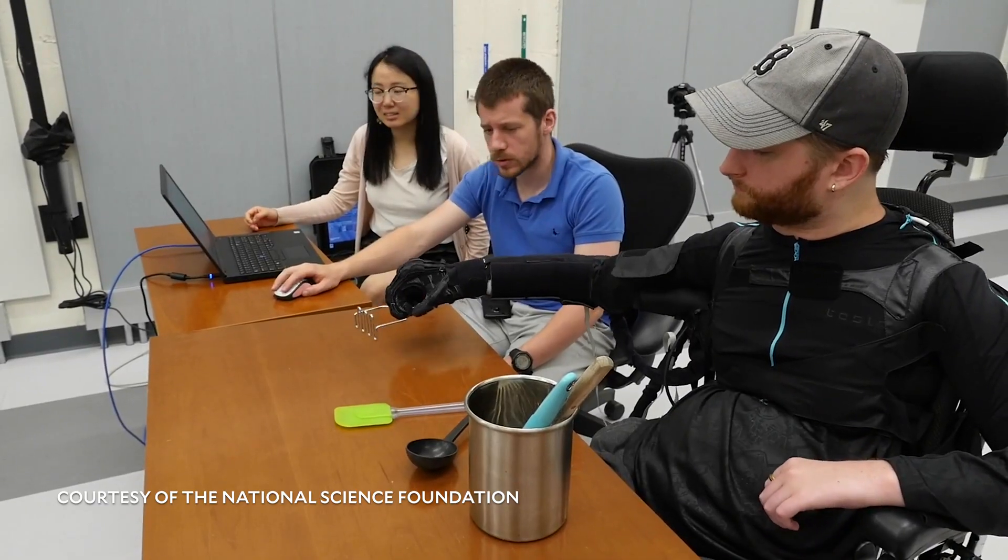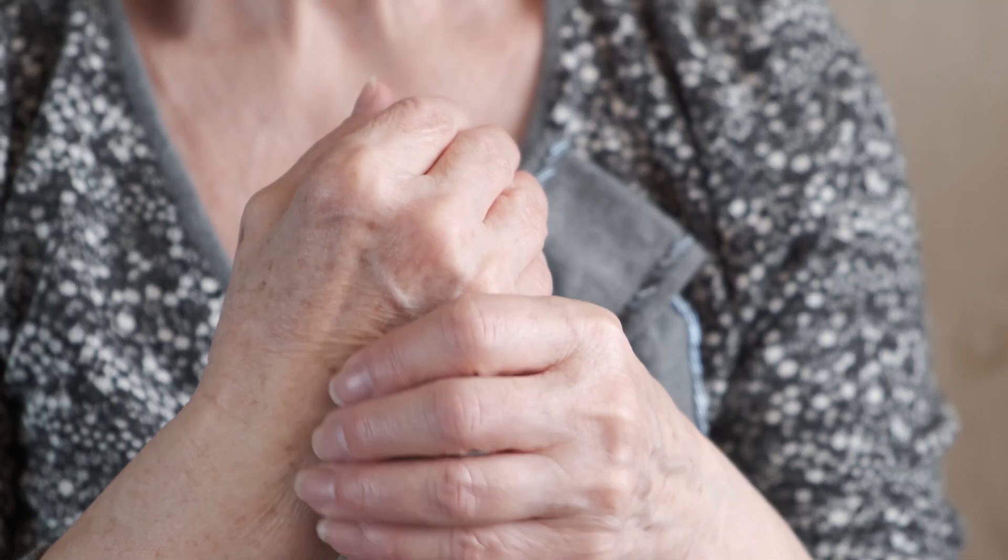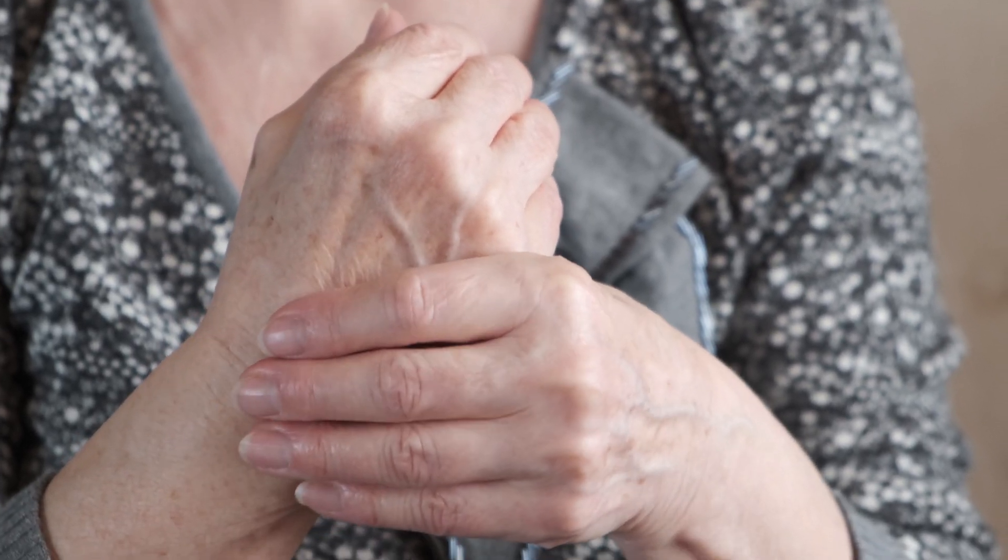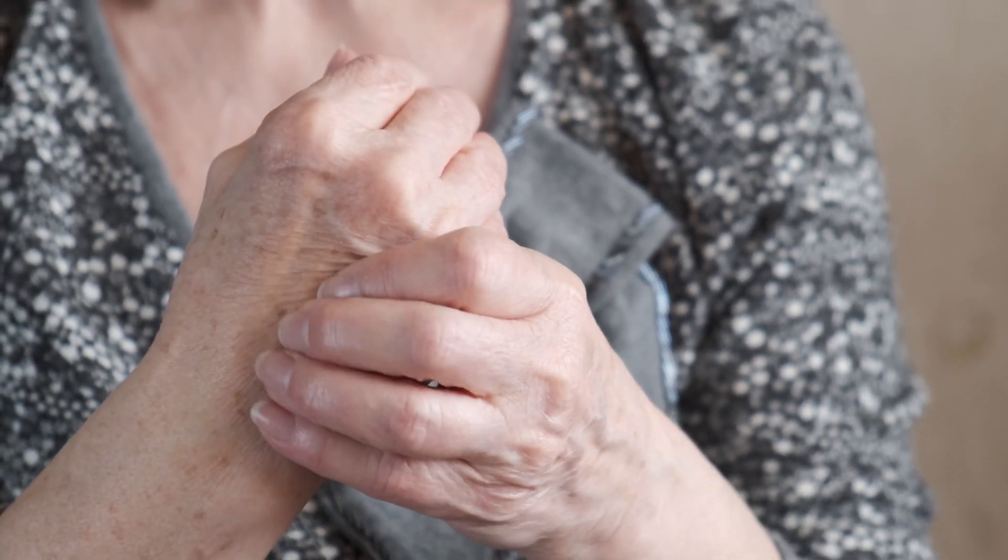There are a lot of wearable assistive devices that have been developed in the past decade, and for good reason. Actually, around 10% of the population reports having difficulty doing things like even lifting a 10-pound object.